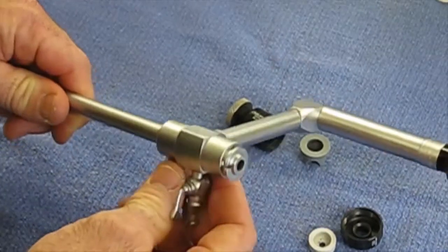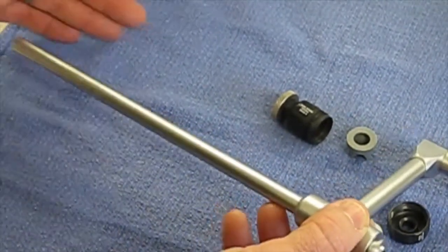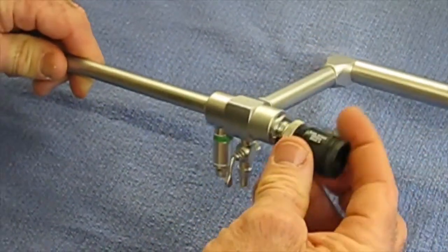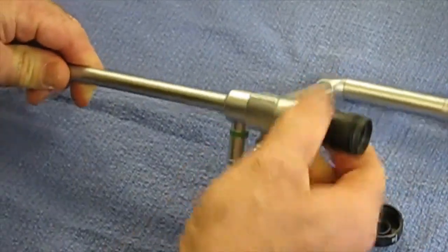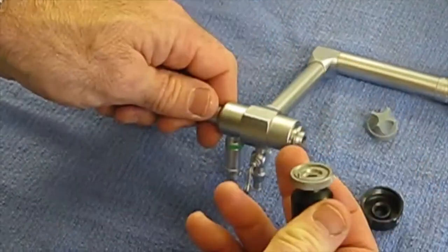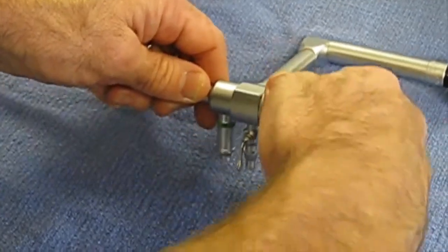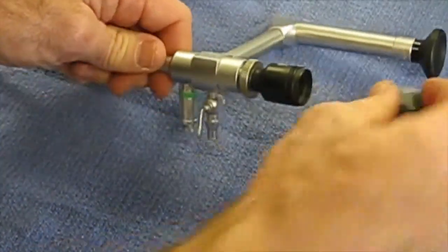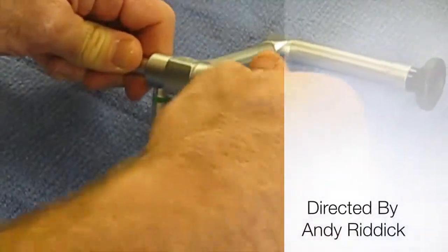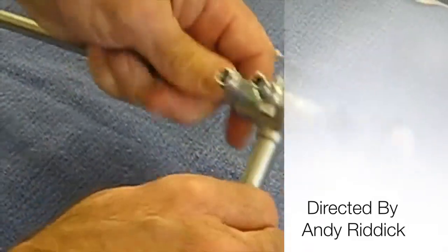Once the scope is cleaned, you want to dry it off with a soft cloth rather than just letting it air dry. And then you can reassemble the scope by putting the barrel valve back on here, where this nipple actually lines up with that groove. And then you put the silicone leaflet valve in next. The cap screws on, and then the sealing bonnet goes on last. And now it's nice and clean.